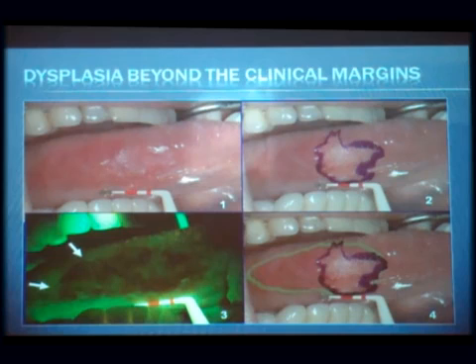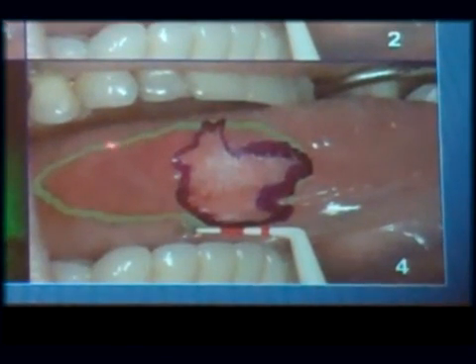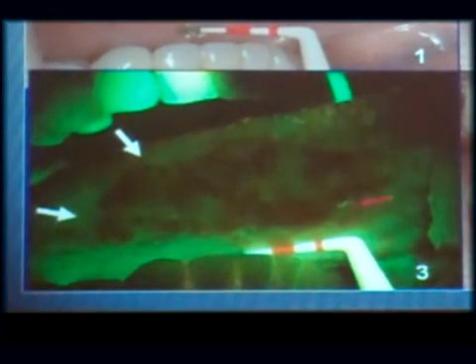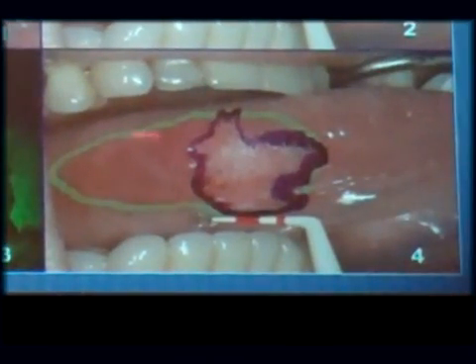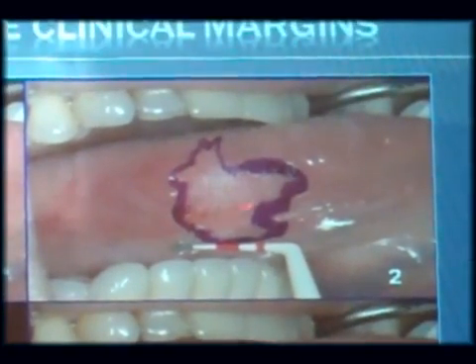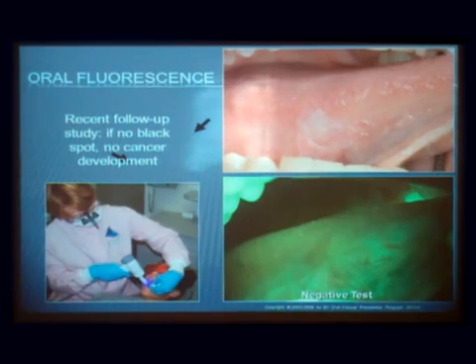And here's a lesion. The surgeon just made a little India ink mark around it, and they took a picture. And then on the picture, they drew a green mark that covered the area that was dark. And there, I think this was 6 or 7 biopsies in this site. And every one of them was dysplasia. So if this was in my office, I would have biopsied somewhere in here and totally missed the real area for the proper biopsy. So I think the problem is that we get too many false, not really false positives, but there are other things in the mouth that cut off the normal fluorescence.